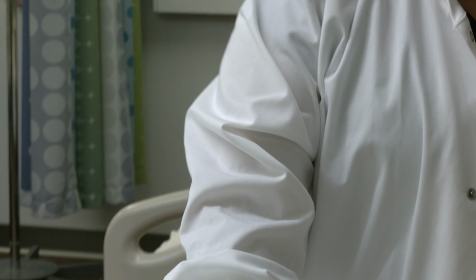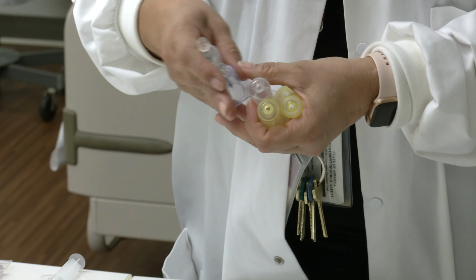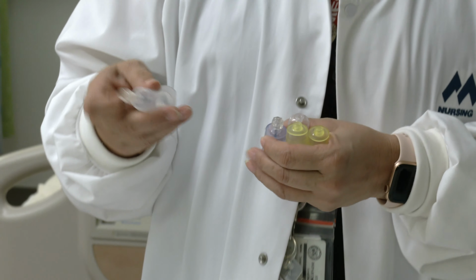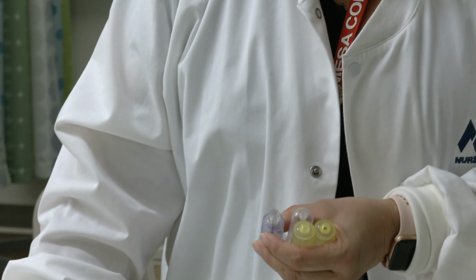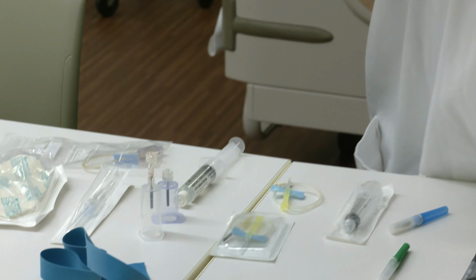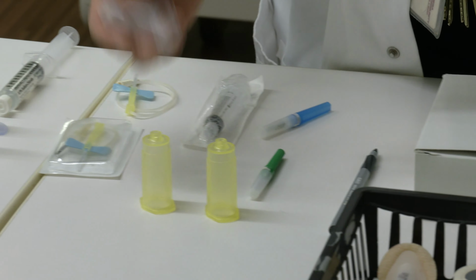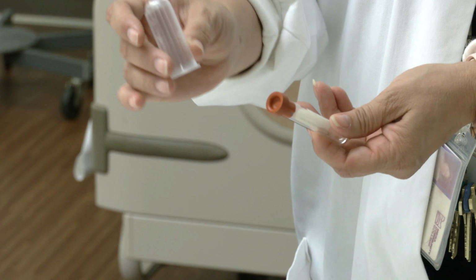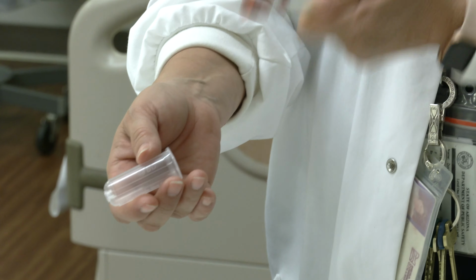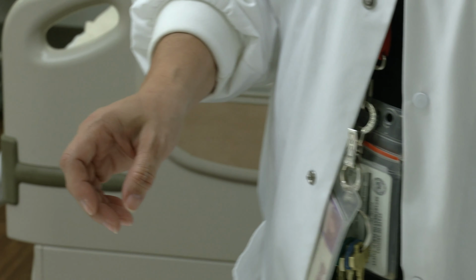And then we have various vacutainers. And vacutainers are different methods of holding your tubes so that the blood can be vacuumed out of the patient into the tube. So these two work with the IVs, these work with other various apparatuses, but what you always want to make sure is that your blood tube can fit right in there, because if it doesn't, then you're going to have already gotten your blood and then you won't have any way of getting it into your tube. So always verify that your tube is going to fit into the vacutainer that you've chosen.